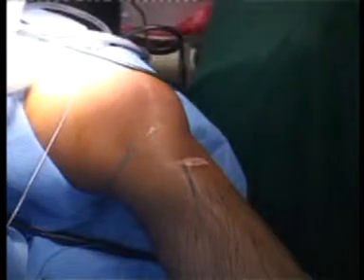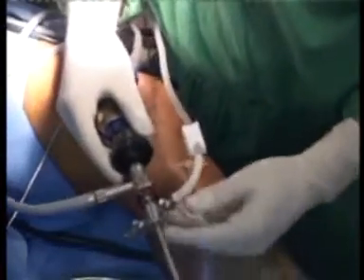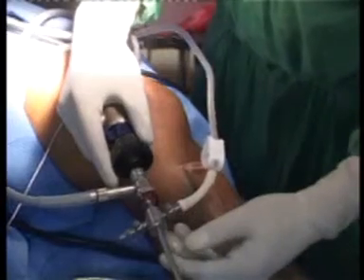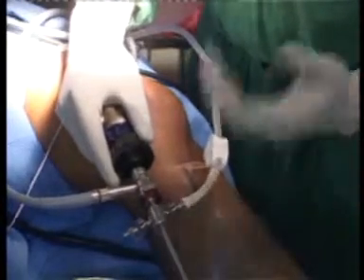Well, Donald Shelbourne still just ties his tibia over a single screw. There's no interference screw on the tibial side. It's purely one single post screw. And he's done thousands.